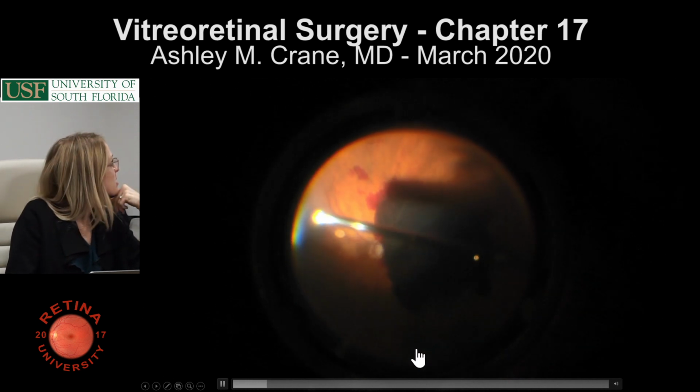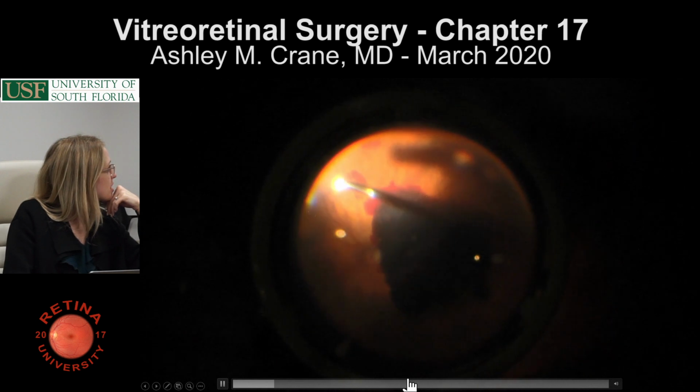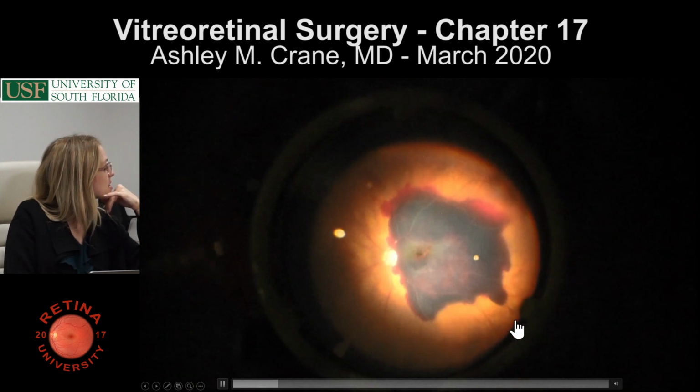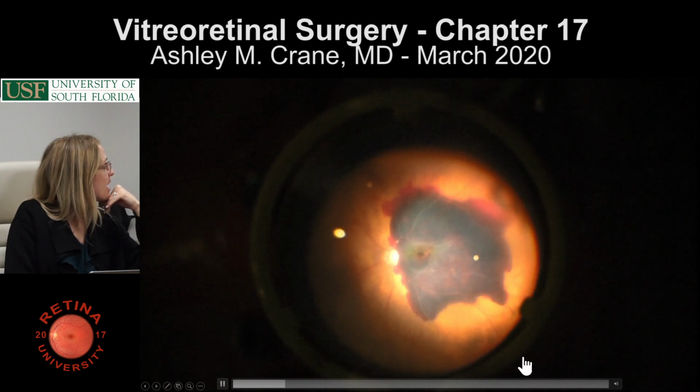Okay, here we go. So basically, a pars plana vitrectomy is performed. Usually the hyaloid would be lifted. You see this huge hemorrhage. I cannot believe that this guy did as well as he did.